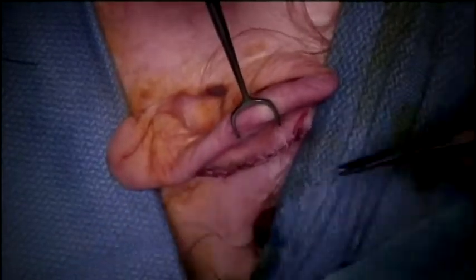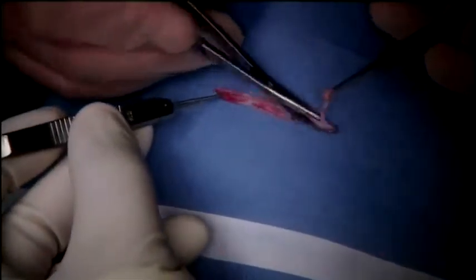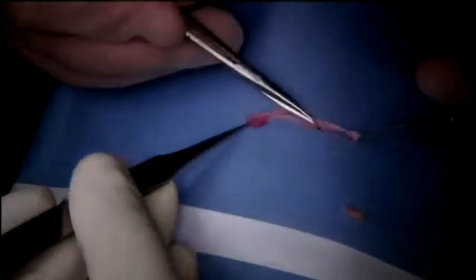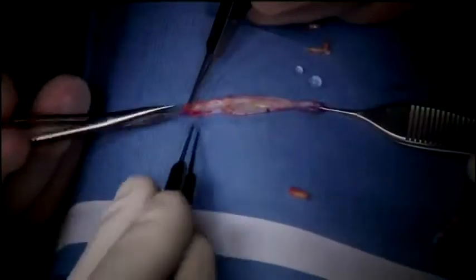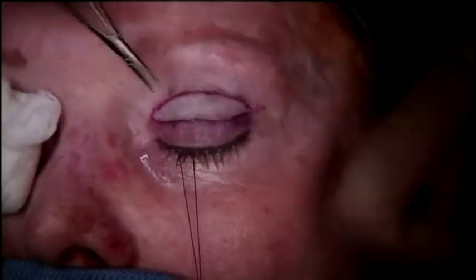And postoperatively, we put some bacitracin ointment. That should be sufficient. Now the skin graft is thin. I use a blunt Westcott scissor to get rid of some of the fatty tissue that's around it. Remember, there is really no subcutaneous fat on the eyelid. So we go ahead and put that in the desired position. As you see, it's a great fit.